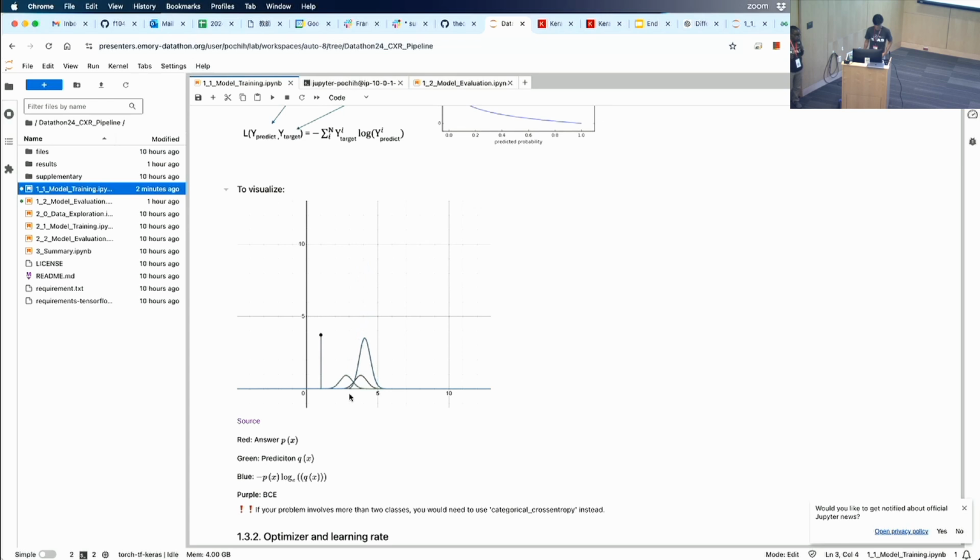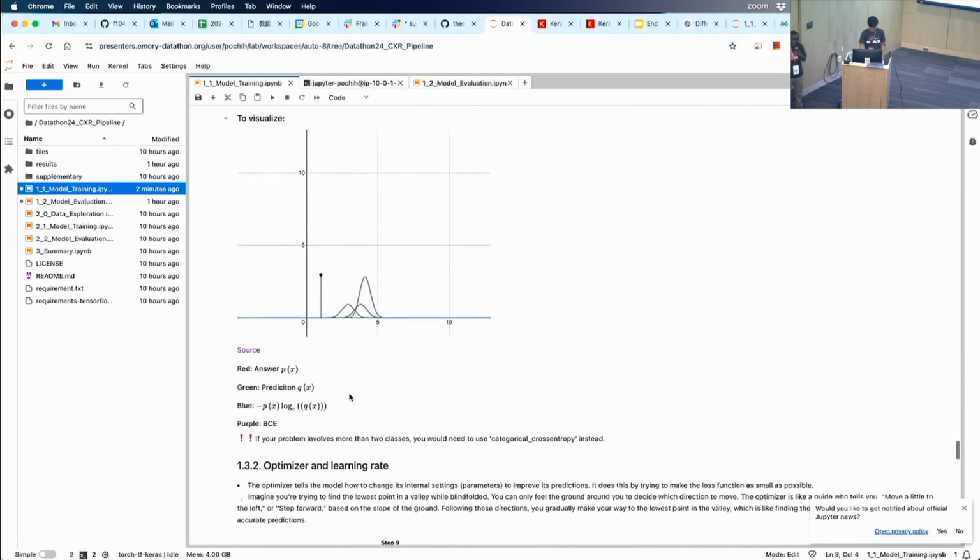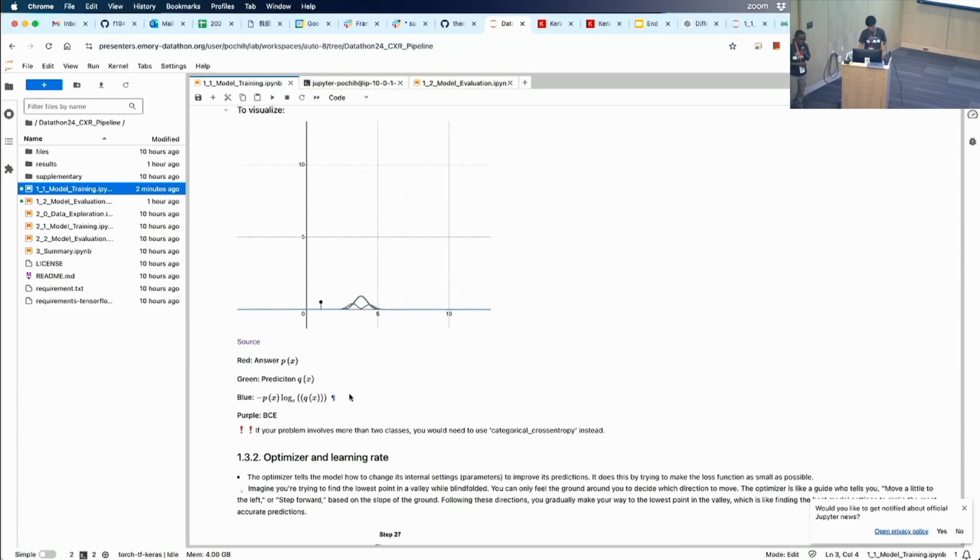If you had a student, like we have students here, and you make a mistake, the way to track that is the loss function. Yesterday we saw a form of loss function, which is the MSE. Remember the work with Saptashi trying to show us the length of stay? You need to know how far you are from the truth. Binary cross entropy loss function is also for binary tasks. So your loss function is guided a lot by the task that you want to do.